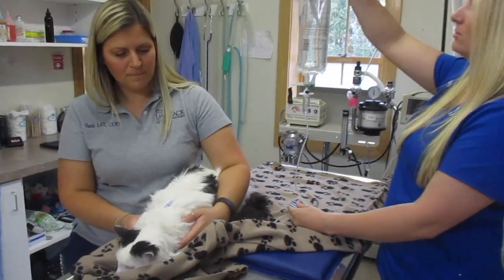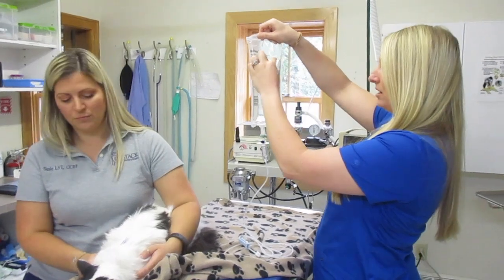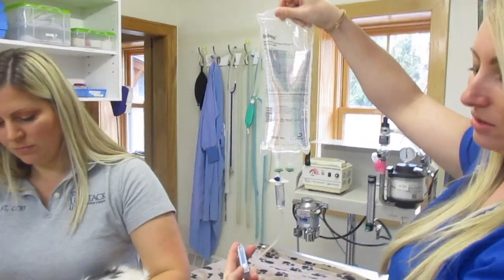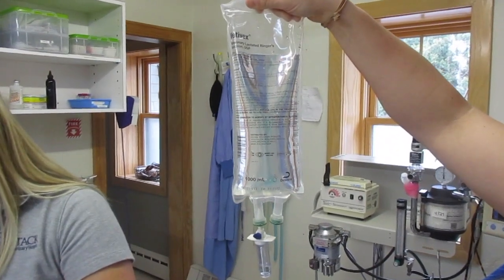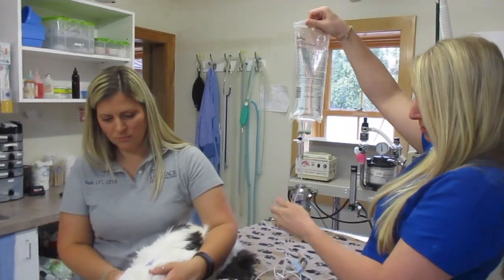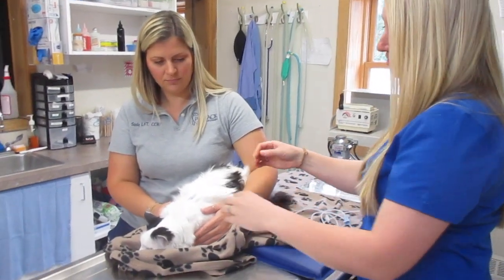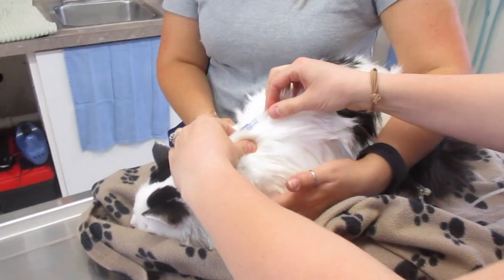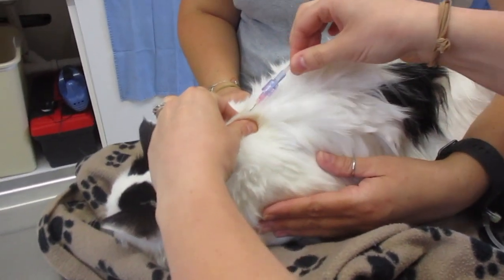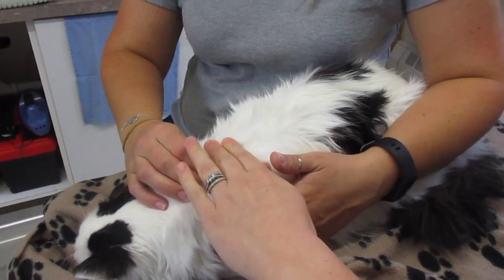So we're just about done with our fluids here, and we were going to 150 mL, so we're going right in between the 1 and the 2. I'm going to take this scroll and roll this back up, and then my fluids should have stopped flowing at that point. So I can set my bag down, and then the next thing I do is pinch where I inserted the needle and then directly pull the needle out. And then your assistant can hold off that area.